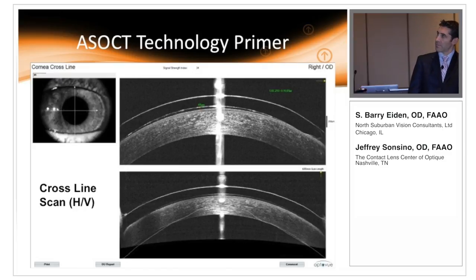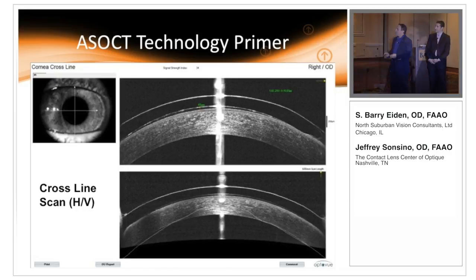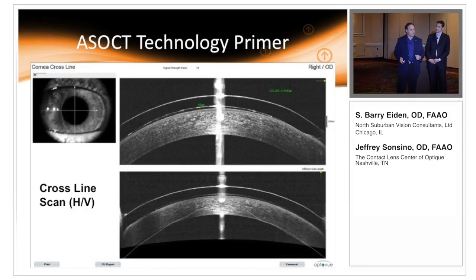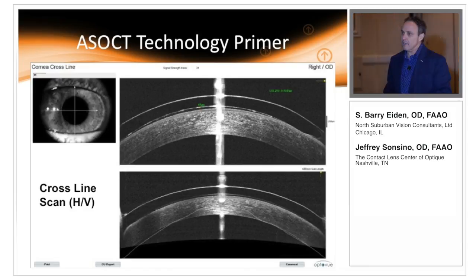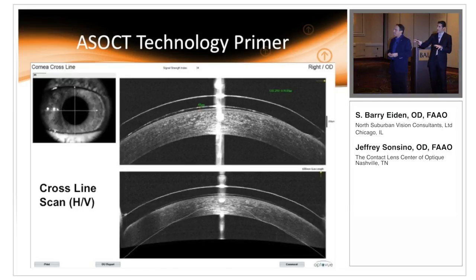Barry's going to talk about radial scans and 3D corneal scans as well. Here is the cross scan, which is really the mainstay of what we do — at least initially in the central portion of the analysis of vaulting lenses. You can see you get a vertical and horizontal cut.